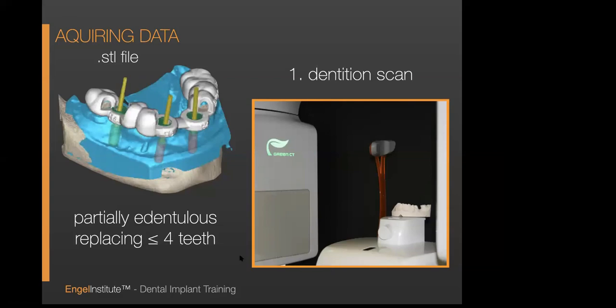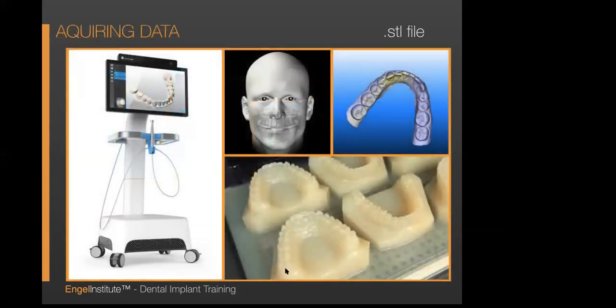Next, for all of those of you who are like me, digital and have iOS intraoral scanners, you can do that. You can take an intraoral scan. You would put 3D Diagnostics or a guide maker of choice into your library, and you would simply send them the file, .stl, and it's no different than sending an email to grandma or grandpa with a picture of your child playing softball. You just grab it, you send it. I'm sure you've all done that.